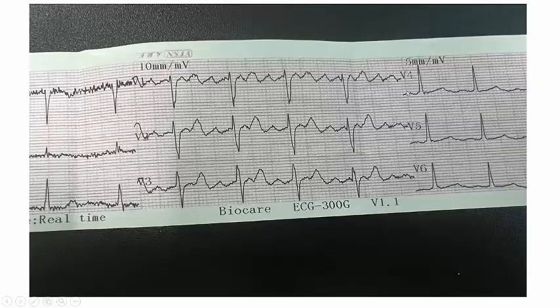The ECG revealed here flutter waves, but this is properly organized atrial contraction. It is a well-controlled atrial flutter with organized atrial waves here. But please, in atrial arrhythmia, you couldn't rely on the A waves, because in this patient there is stunning of the left atrium. Because of this stunning of the left atrium, you cannot rely on the E over A ratio.